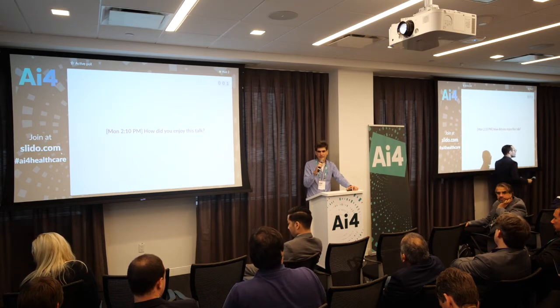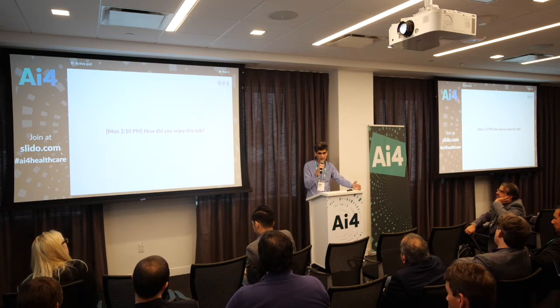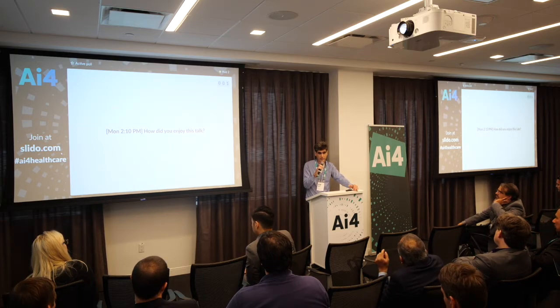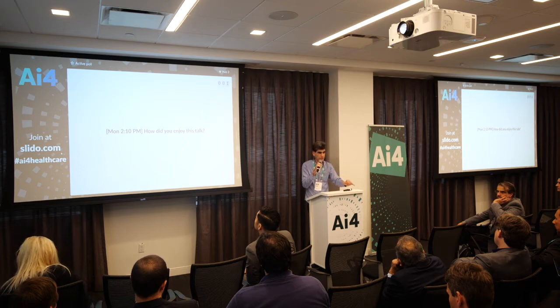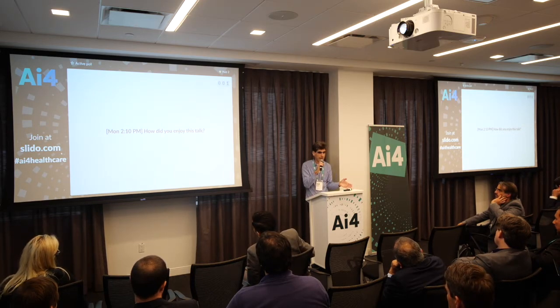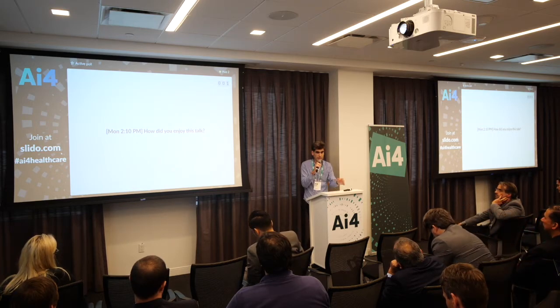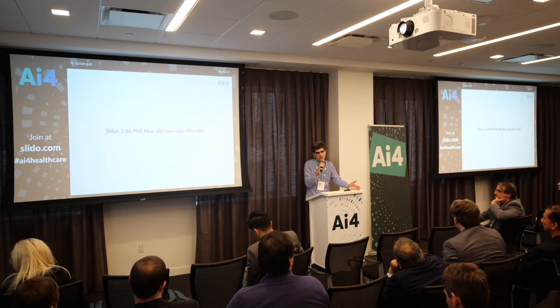So the type of solution I described now is the go-to for such tasks, but if the cells are too rare, if you really have very few positive examples of the type that you're trying to pick up, then you're in trouble. You need to figure out something else. You need to do anomaly detection. It becomes a more challenging task technologically. There are ways to go around it with different classes of solutions that I've not described here. You can train a network to detect anomalies on only one class of examples, and you try to pick up things that are different from that. That might be helpful. If the data set is too small, then yeah, you're stuck.